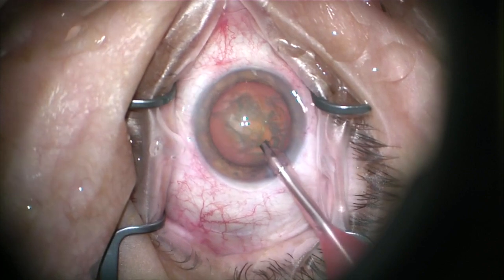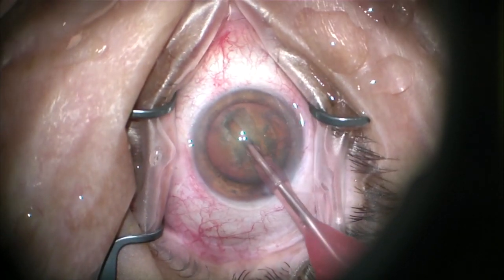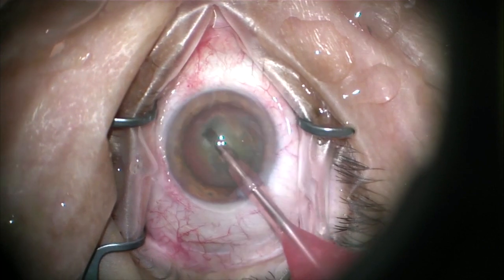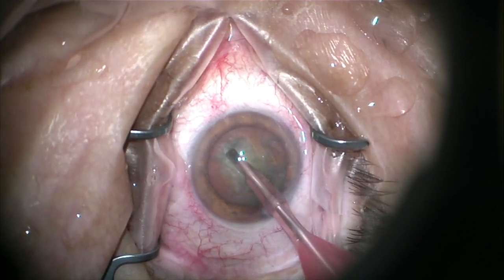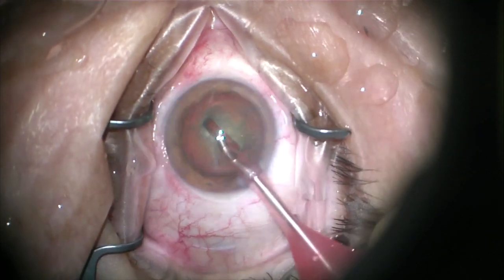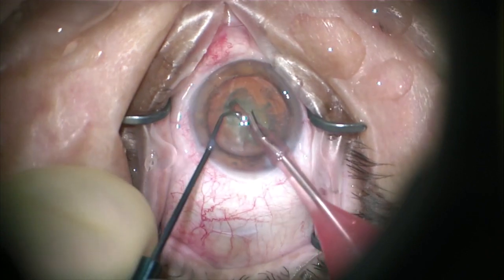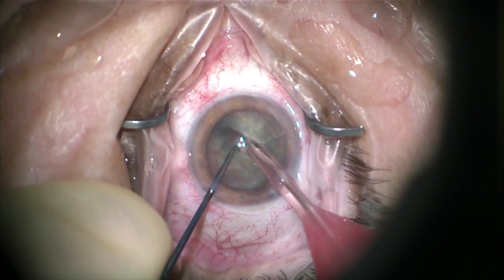Anybody who's operated with me will know that I say it's all about the crack — we want to get a good crack. If you don't get a good crack, the nucleus extraction, especially the divide-and-conquer nucleus extraction, is probably going to torture you the rest of the case. If you do, it'll be very easy. So we're going to make a nice straight deep groove. The diameter of your phaco tip is just over a millimeter, and most lenses are about five millimeters thick, so you can make three full-thickness passes with impunity — you don't have to worry about anything.